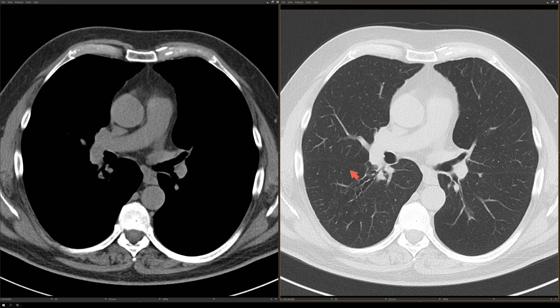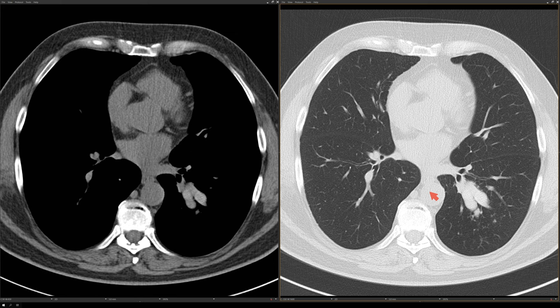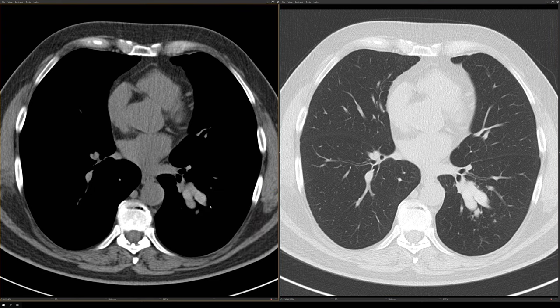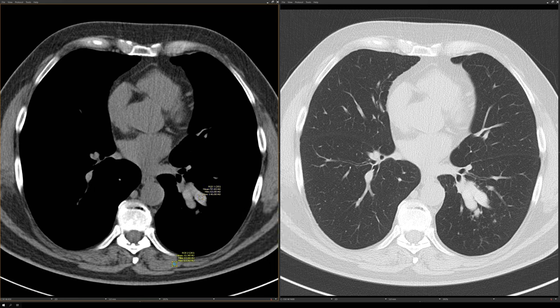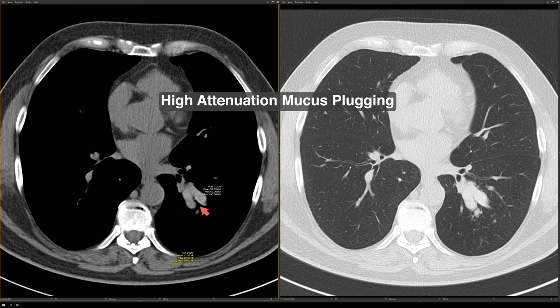There's more bronchiectasis here in the superior segment of the right lower lobe. And then we come to the elongated opacity that we saw on the chest x-ray. On CT, it turns out to be this branching structure that correlates with a dilated bronchus. On the soft tissue windows, we have an important clue: the internal attenuation of the mucus plugging is dense — in fact, it's even denser than skeletal muscle. Putting a Hounsfield unit on it, it's 97 Hounsfield units compared to skeletal muscle, which is only 42 Hounsfield units. So I would call this high attenuation mucus plugging.